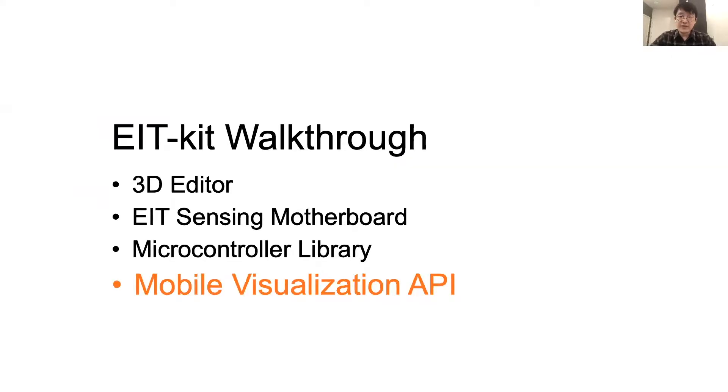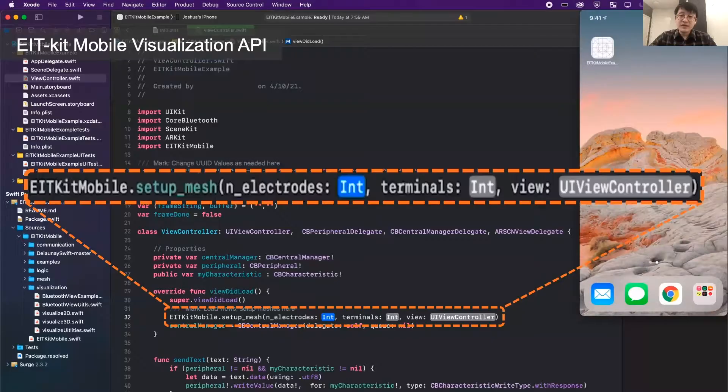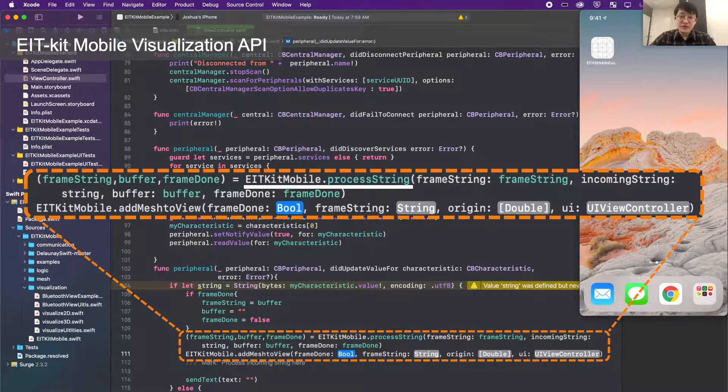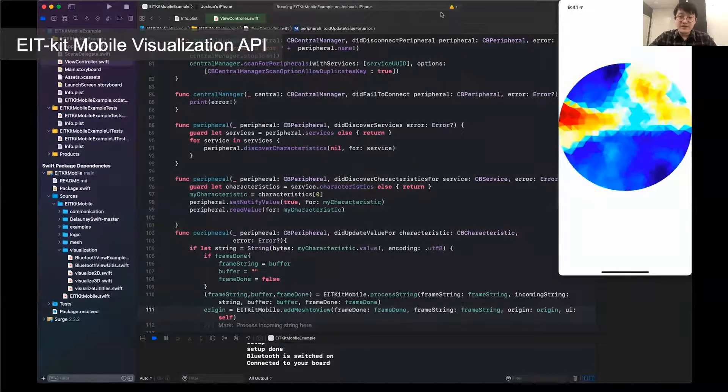Once users have the measured EIT data ready, they can move on to the mobile visualization API, which communicates with the EIT Kit microcontroller library via Bluetooth. The EIT Kit mobile visualization API is built on Xcode and can be used on iOS devices such as iPhone and iPad. Users start by creating an empty object in Xcode IDE and importing the EIT Kit image reconstruction API into the project. They then initialize the UI view controller template as well as Bluetooth, set up the number of electrodes and measuring configurations for two or four terminal measurements. Next, the user calls the process_string function, which solves the conductivity distribution, then calls add_mesh_to_view to apply the solved results mapped onto mesh faces. Finally, upload to the mobile device and see the 2D visualization of the EIT data in real time.